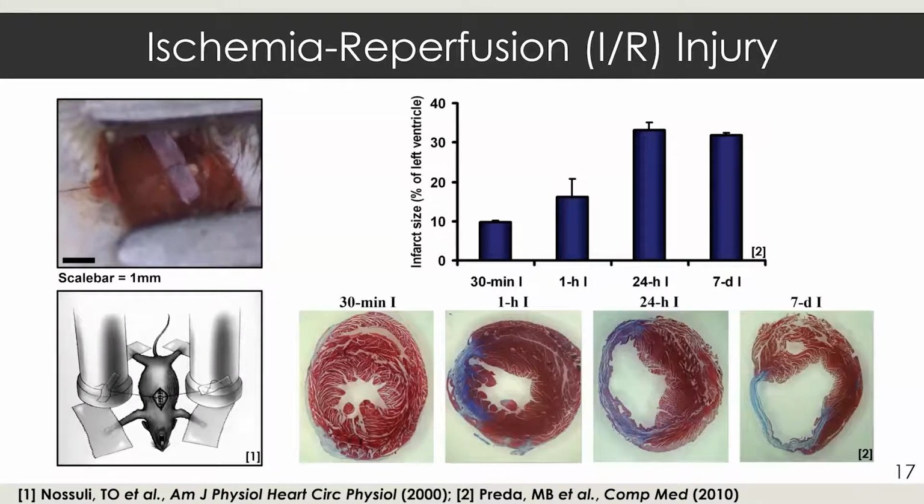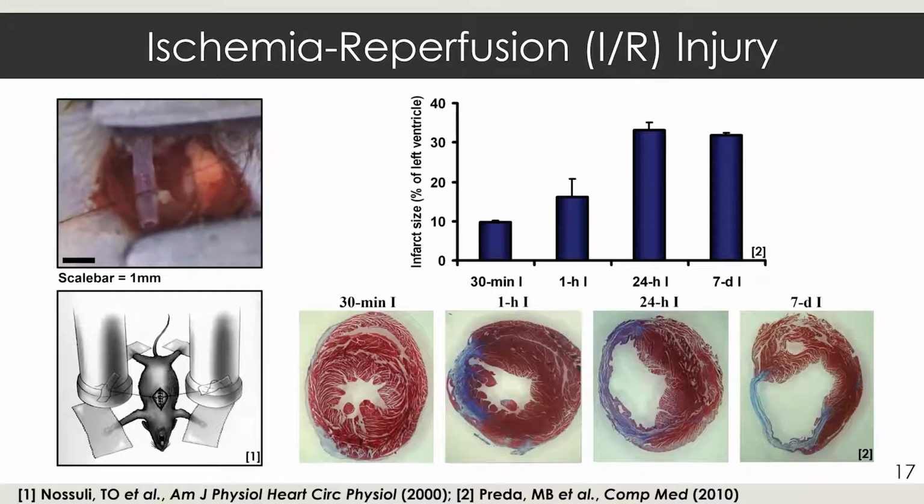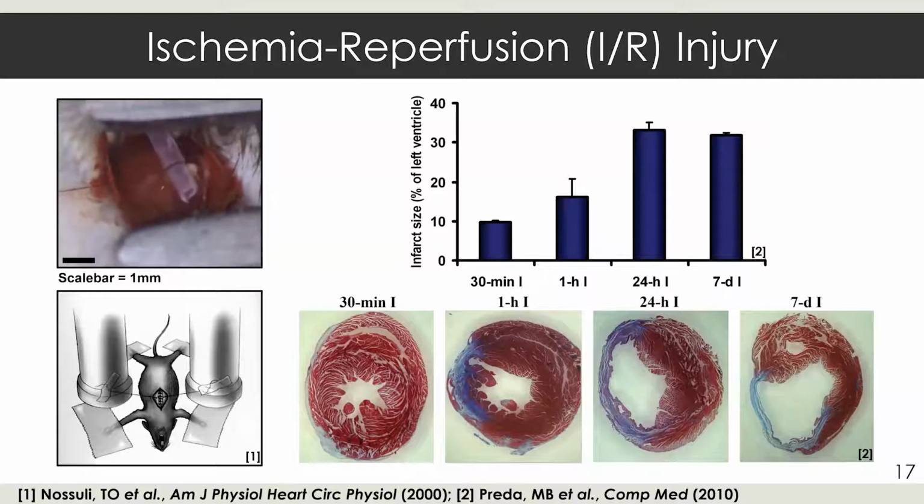Arvin, can you comment about the Simpson's protocol and how that might compare to a 3D, 4D acquisition of the heart? Right, so the very first publication and study that I did was actually comparing 2D approaches for LV function with 4D approaches.